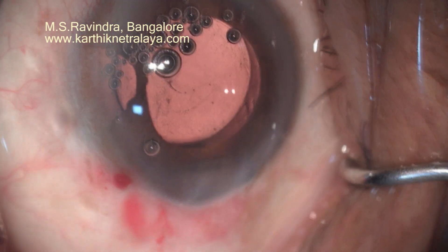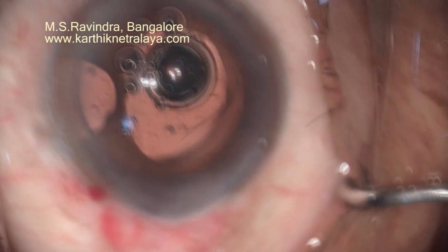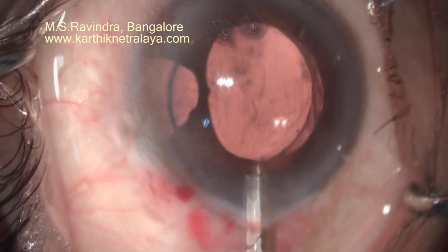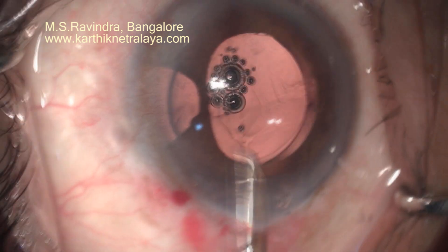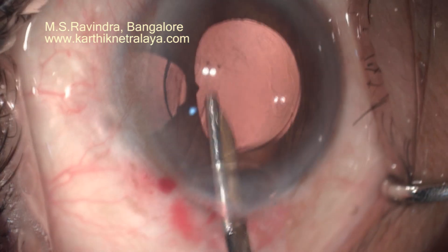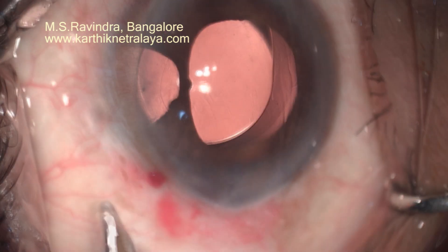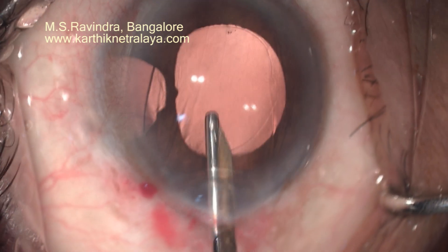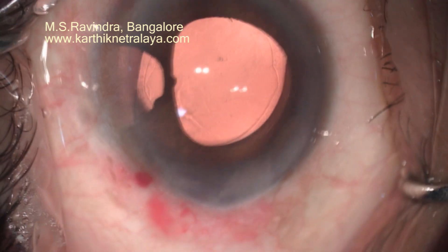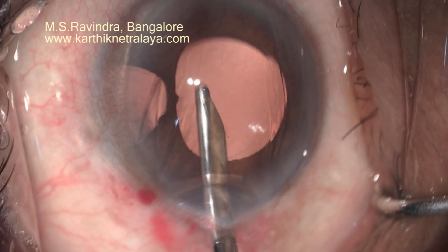The lens is rotated, and it is important to aspirate the entire amount of viscoelastic from the eye — from the capsular bag, from the back of the IOL, from the angle regions all around, and from the back of the endothelium. This will minimize post-operative pressure hike and the patient will be comfortable without any pain or photophobia. The eye is left open with no bandaging needed, as the tunnel was not overstretched, eliminating concern about post-operative aqueous leaks or cross-infection. Drops are started.